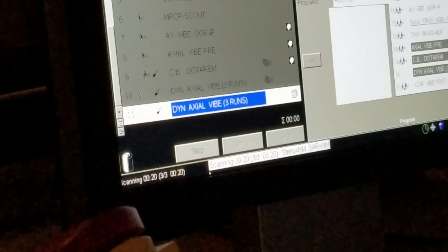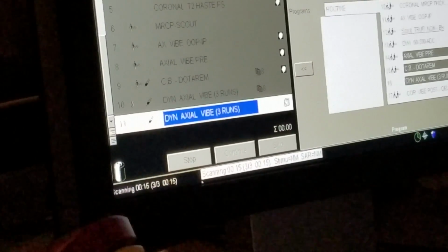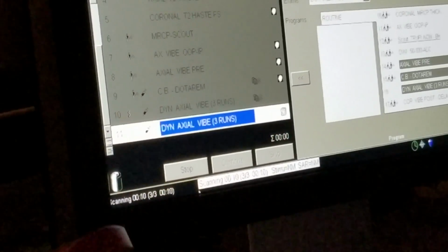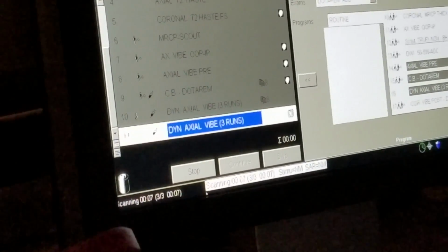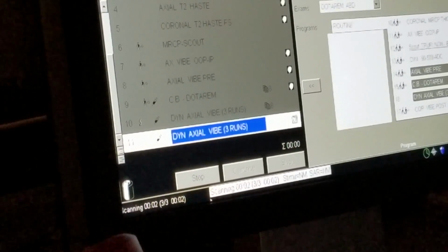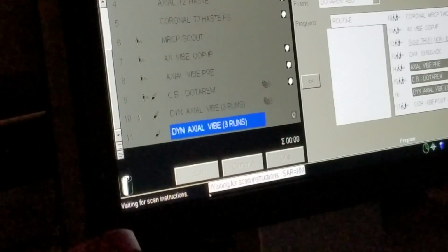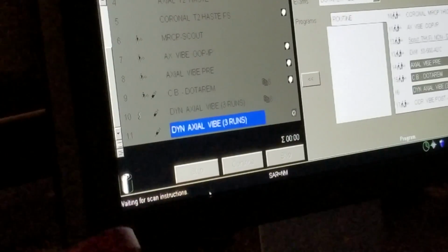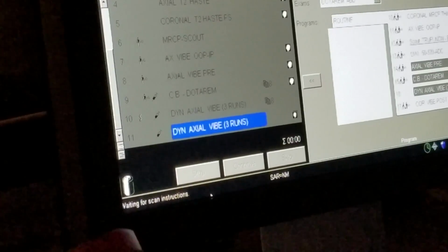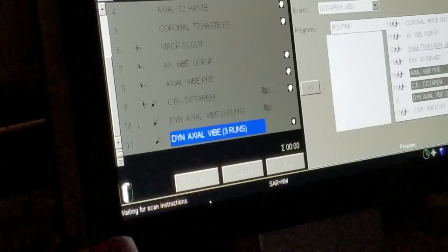So the first phase should have just the portal vein, not the hepatic veins. On the second phase, everything arterial should be not quite as bright. The spleen would go from a mottled appearance to a more solid, homogeneous appearance. Same thing with the kidneys. You'll still see the portal vein. Breathe, but now you'll also see hepatic veins bright. And then on the third dynamic phase, everything is sort of the same intensity of contrast, hence it being called equilibrium. Being called a what? Equilibrium phase.